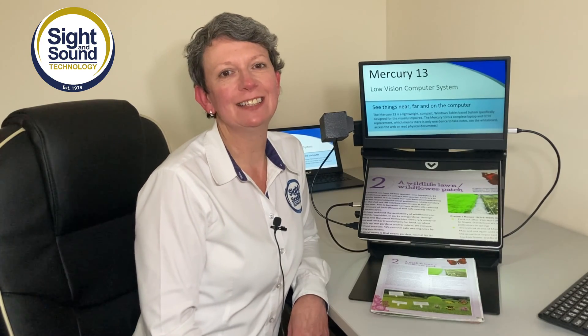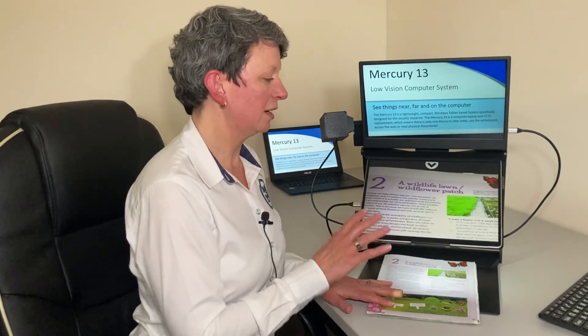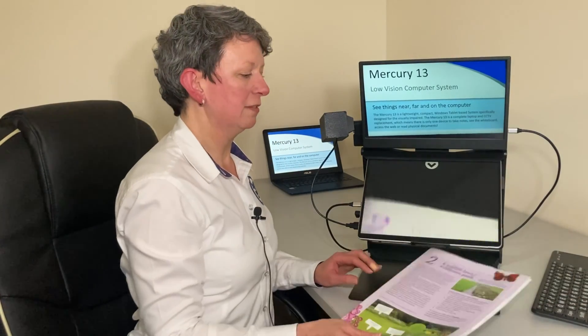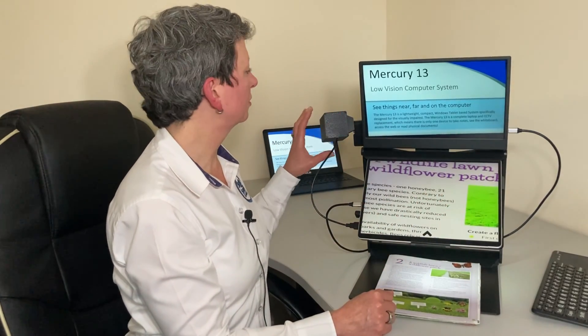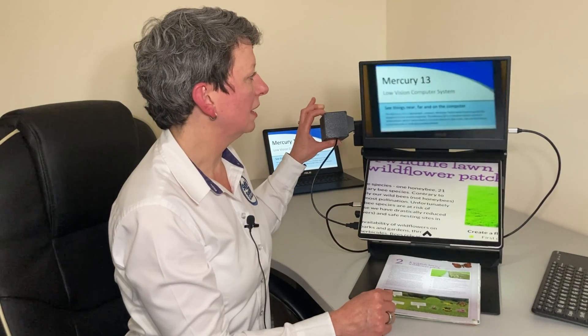Hello, my name is Sharon Lyons from Sight and Sound Technology. Today I'm going to show you the Mercury 13 education system, which is an all-in-one solution for students working in schools, colleges and universities. It is a Microsoft Surface with a keyboard, giving you laptop capability, a feature for near magnification for books and worksheets where you can zoom in, and an optional second screen with a distance camera for zooming into the whiteboard.